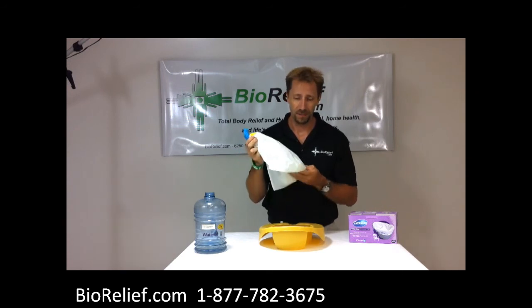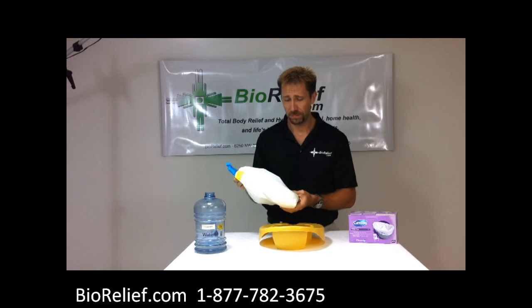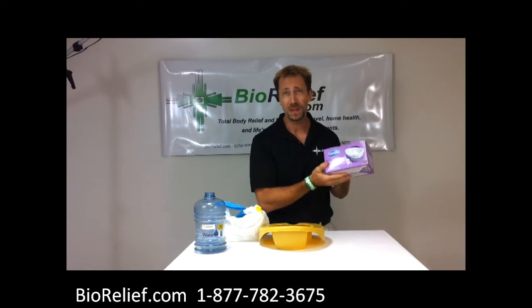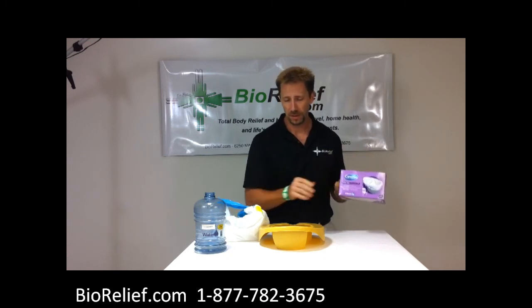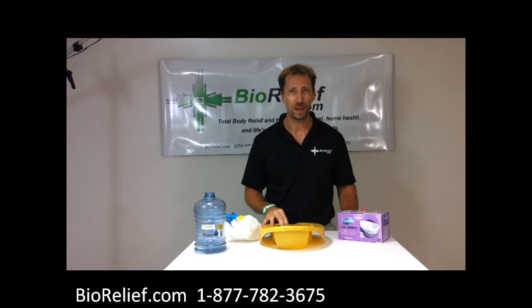It's now safe for the environment, and it contains the odor once again, and now the job is much easier to do. This also comes for commode liners as well — same type of towel, same type of bag, just different application. You can find both of these on Biorelief.com, and if you need any more information, please visit our website. Thank you very much.